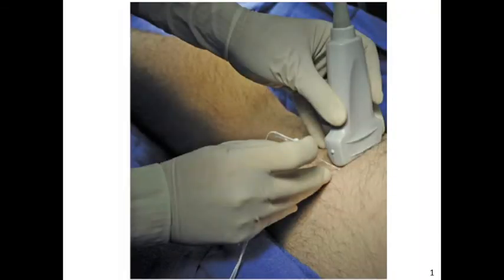Once you have identified all those key landmarks, you can set up to perform the nerve block procedure. The preferred approach to this block is the in-plane technique. The needle enters the skin just lateral to the probe and is advanced from the lateral to medial orientation towards the target under real-time ultrasound guidance.